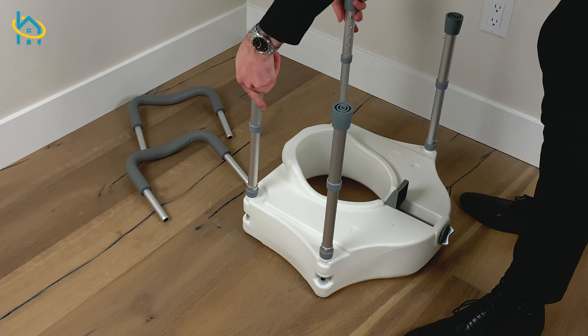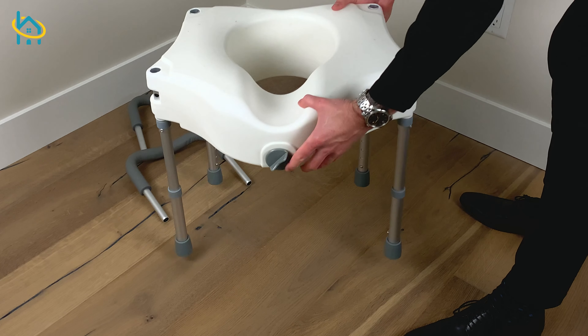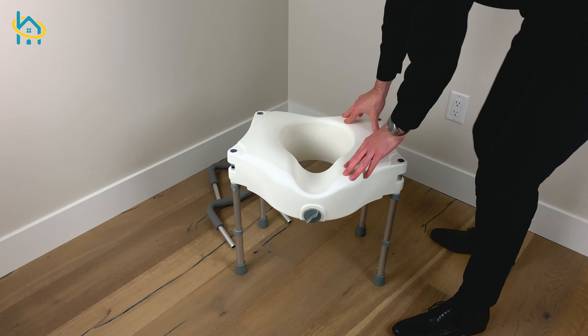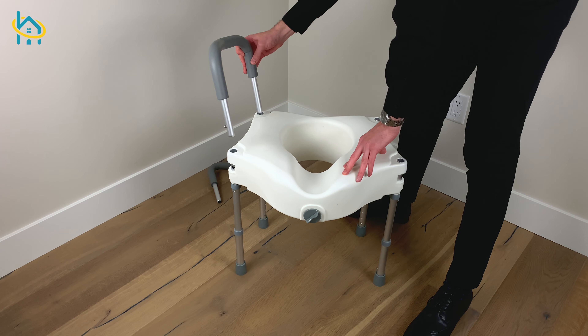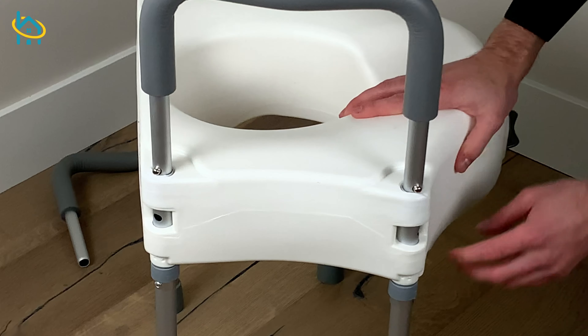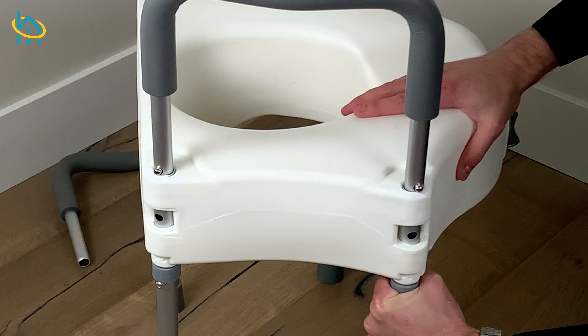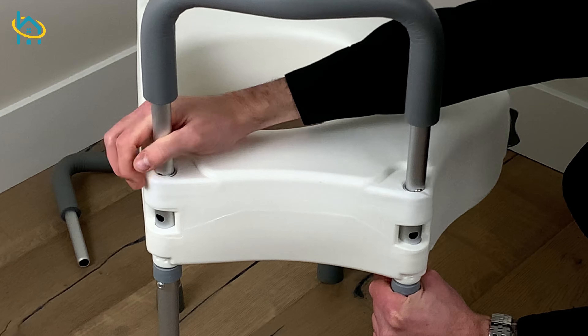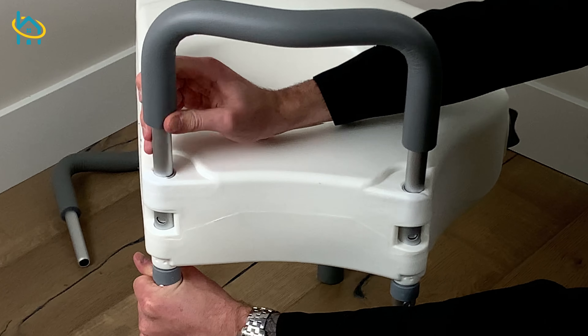Once all the legs are in place, flip the seat over. Now you're ready to install the armrests. Grab the armrest and make sure the pins on the base are facing outward. Press the pins in and push the armrest into the base. Adjust the position of the legs so the hole and the pin are aligned.